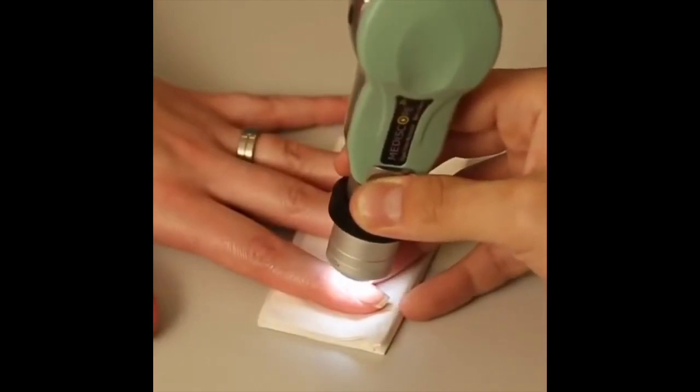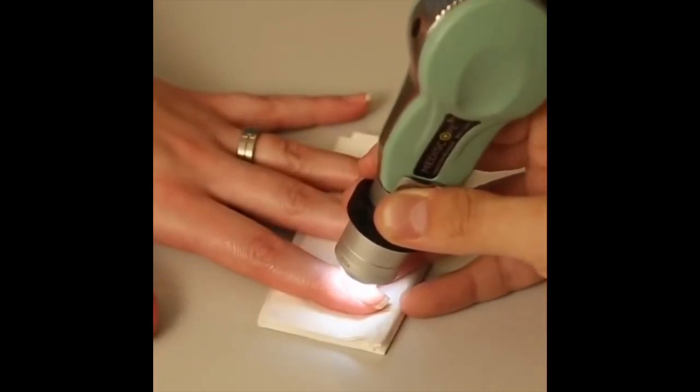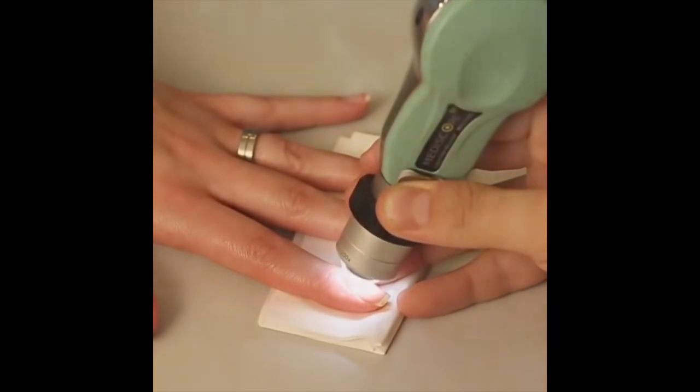If we get narrow, regularly arranged capillaries, like in this photograph, it denotes that this is a primary Raynaud's.